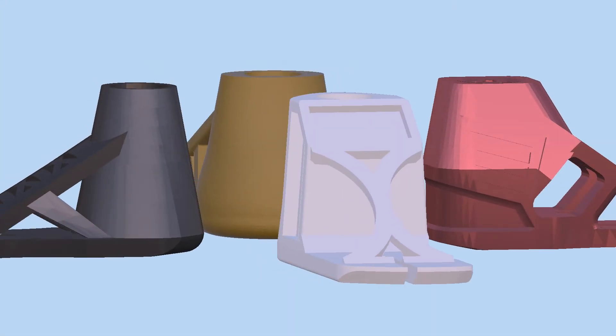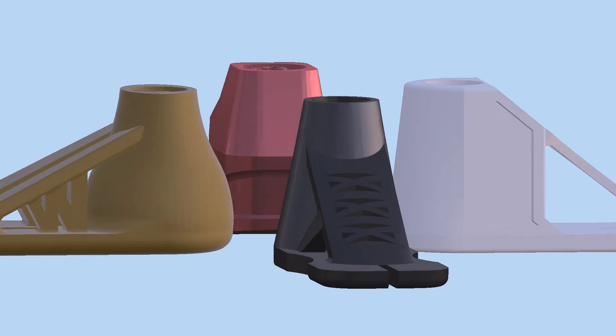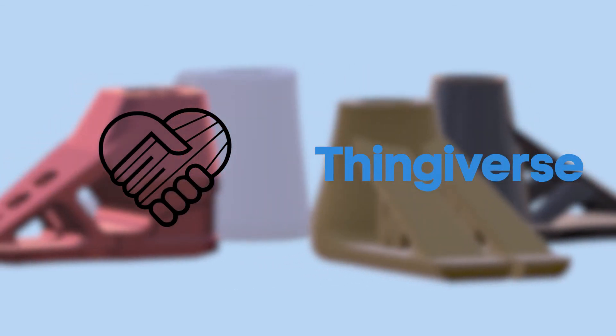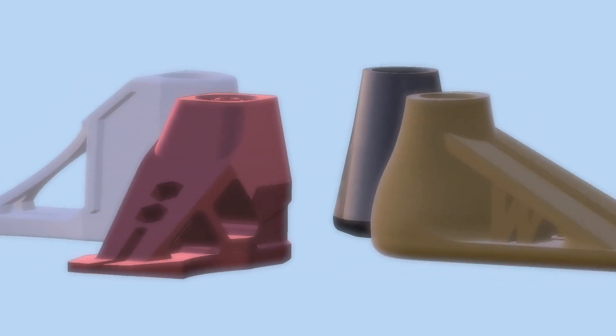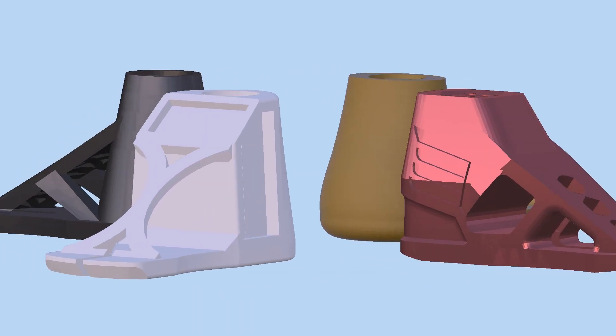Looking forward, we hope to incorporate NinjaFlex into all the designs of our prosthetic foot set to add more shock absorption and flexibility. Our CAD files will be available through Enable and Thingiverse so people around the world will have access to it if they need it. We've enjoyed being able to design a foot that will have a positive impact in people's lives.